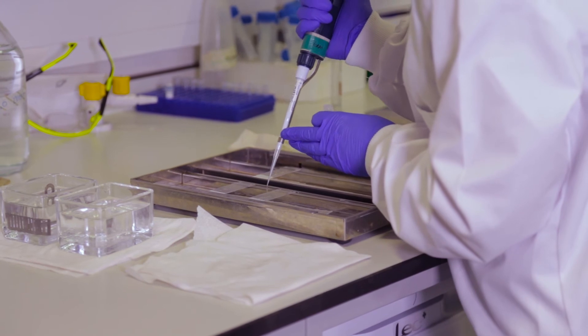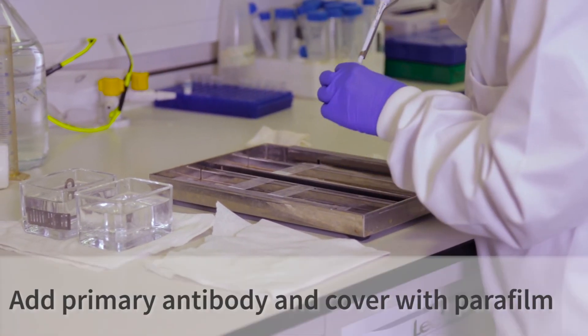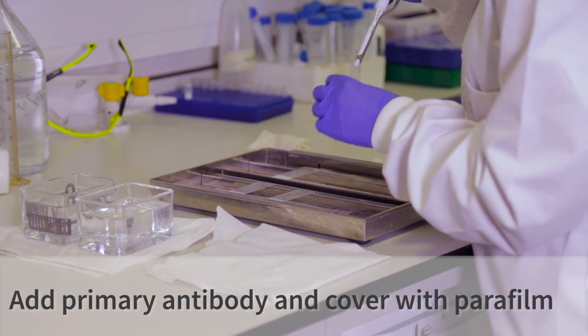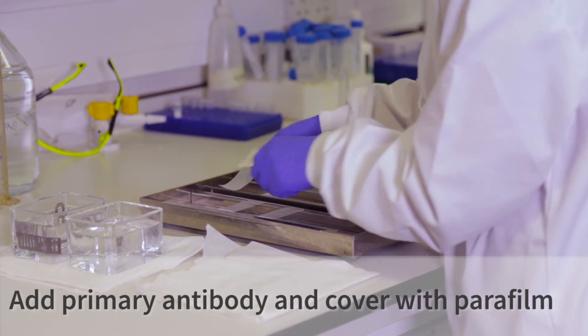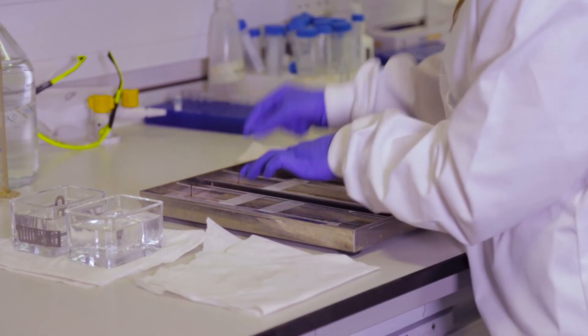Next, pipette on your primary antibody solution. This is made up by adding your primary antibody to the blocking solution from previous. Then, cover the slides in parafilm and leave overnight.